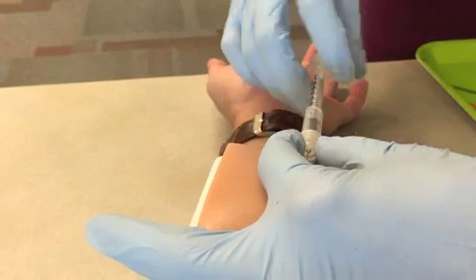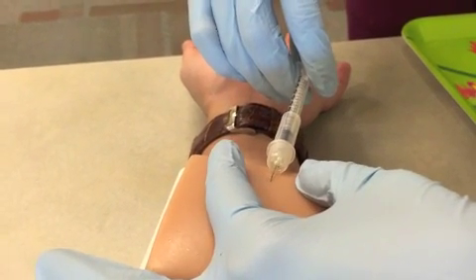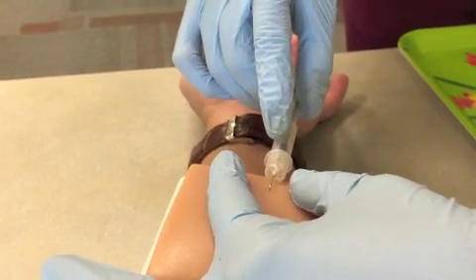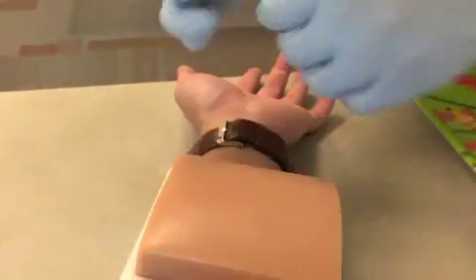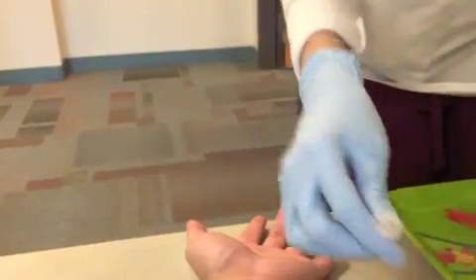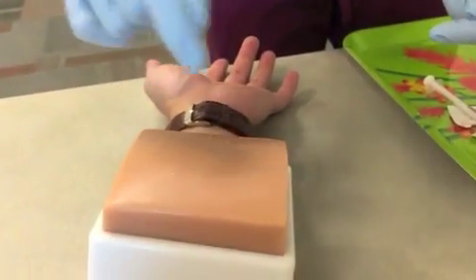And then you go ahead and just watch until you see a little wheal. When you draw it out, you want to make sure you keep your 10 to 15 degree angle. Safety, one hand. And then you twist. And then you want to mark the area around it with a pen or marker.